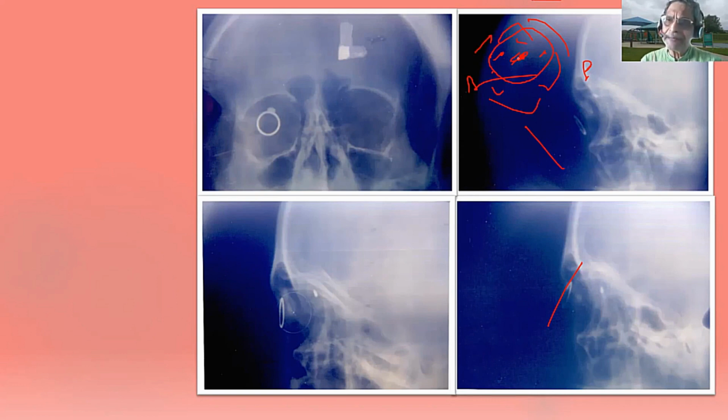That's a drawback here. One more drawback, the examiner may or may not agree, I'll tell you. Sometimes the foreign body is outside the orbit. When I move the eyeball, the foreign body will not move. You know that.